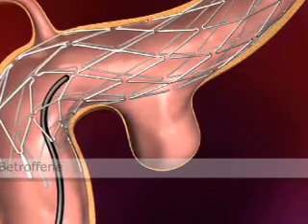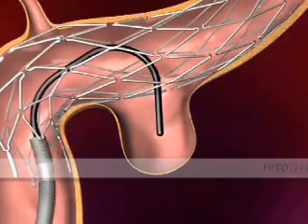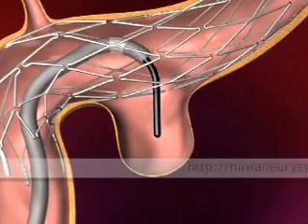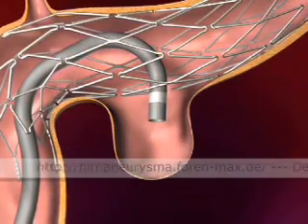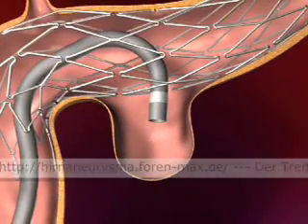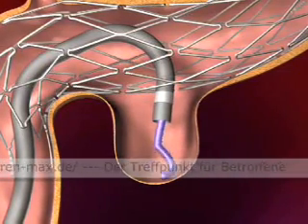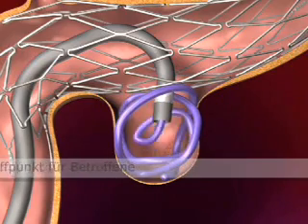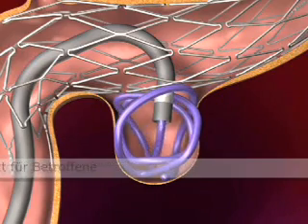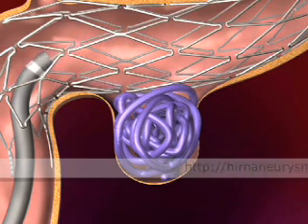Aneurysm embolization. Standard microcatheters with a distal tip OD of less than 2 French may be carefully placed through the interstices of the stent to place embolic coils in the aneurysm. Once aneurysm occlusion has been accomplished, the microcatheter is withdrawn from the aneurysm.